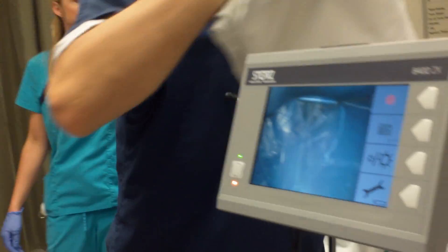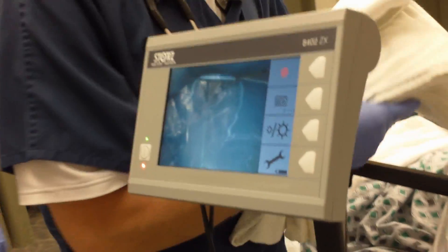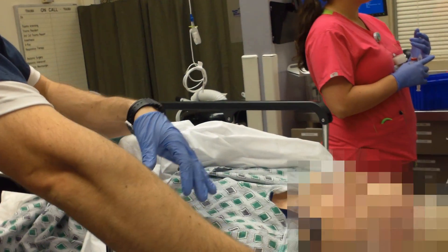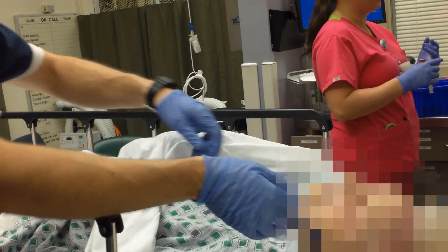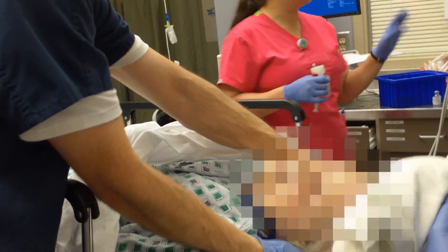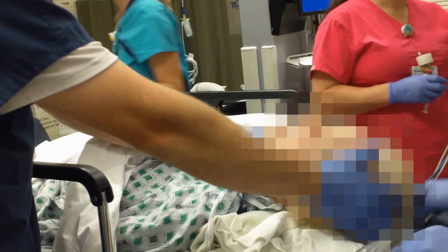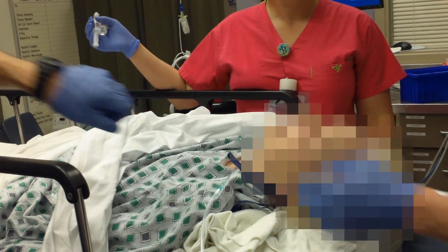What Dr. Jones is doing here is he's going to ramp up the head appropriately, so we're going to try and put the tragus of the ear at the sternal notch. Slide this under. Tragus of the ear at the sternal notch.